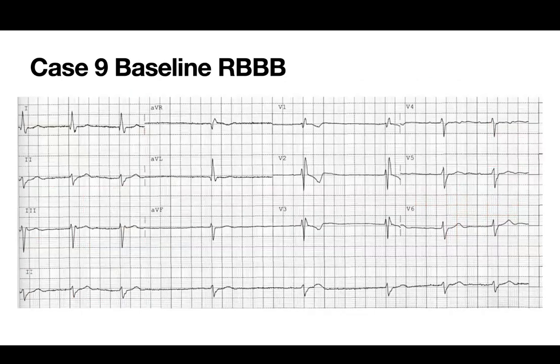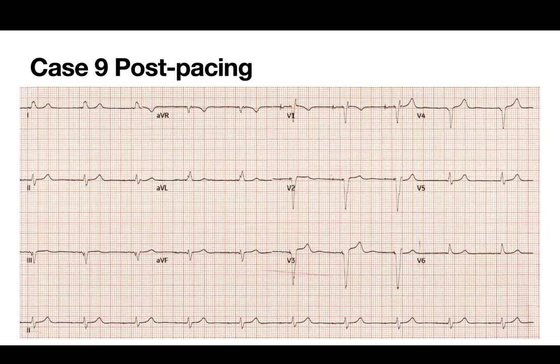This one too is a native right bundle branch block, intermittent second degree AV block, and so on. We positioned it here. Again, very small R prime, LVAT about 75, 80 milliseconds. My question for Dr. Philippon, Dr. Paredes, Dr. Rene, Dr. Joza, all these people who've done tons of cases: would you advance this one further based on the ECG, or would you have left it like this? It was a single deployment. I went in, I saw this, and I stopped. This is where I stopped for this patient, but could we go a bit more?